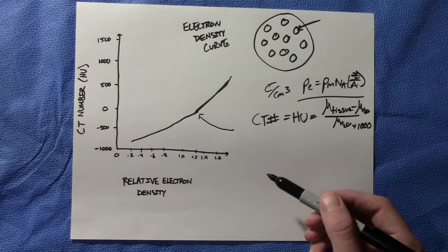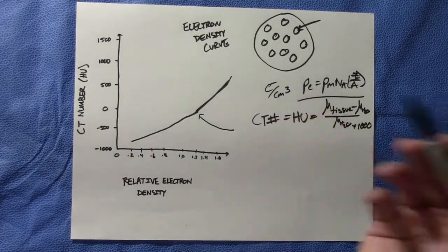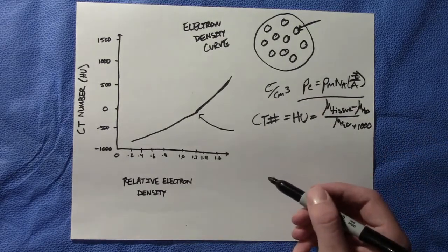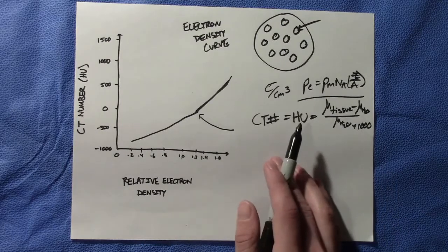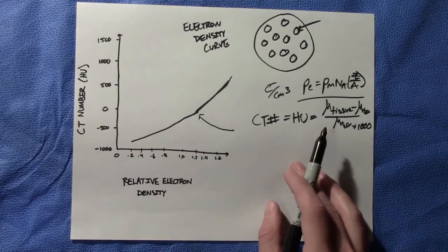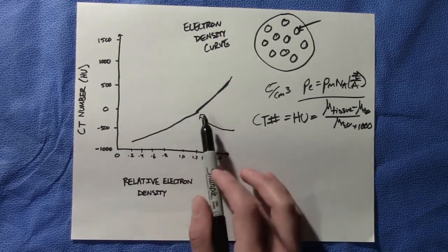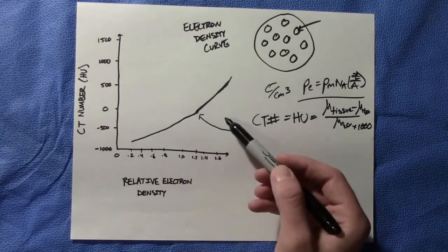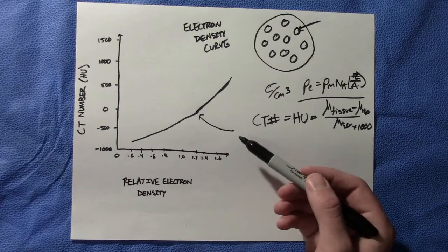You don't use an MRI for this, mainly because it assumes homogeneity and the magnetic field may not be uniform, so you would get possibly incorrect values and some geometric distortion. So for CT, you really only need one of these graphs. There's no reason to use several phantoms and come up with many relative electron density curves.